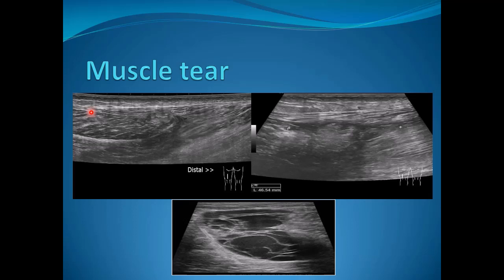Chronic or old muscle tears can be seen where the muscle fibers are retracted without any surrounding collection. In this case, surrounding fluid indicates that the insult is a recent one. Another example of an intramuscular hematoma is also noted.